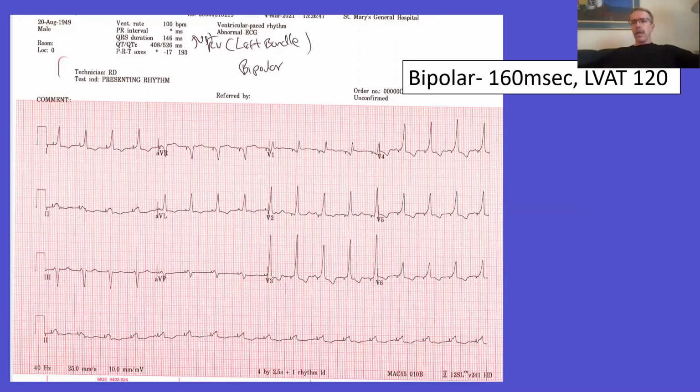Okay. So I personally don't do septograms every time. To be honest, I look at my pacing parameters, and I don't ask them to open a bottle of dye just to, I don't find that. So I can't tell you that. This was a follow-up, like 72 hours or a week later. This is something that I had not recognized in the operating room.